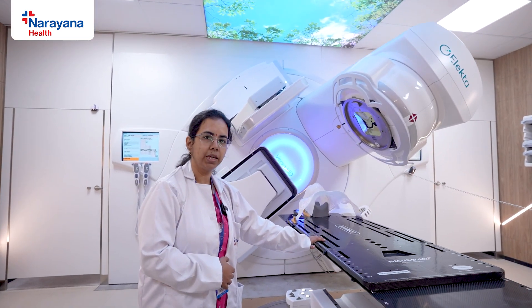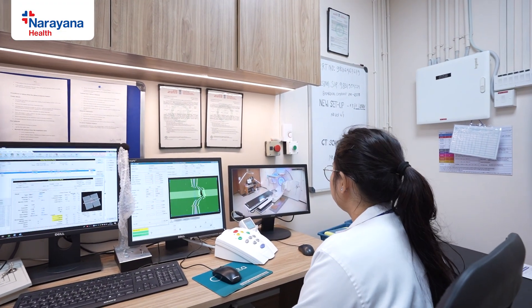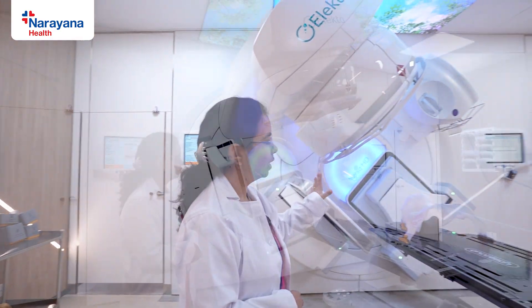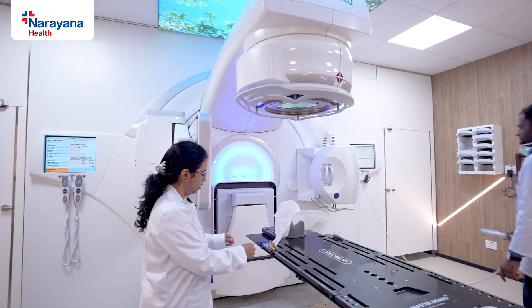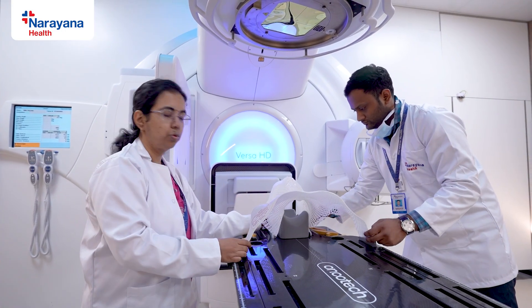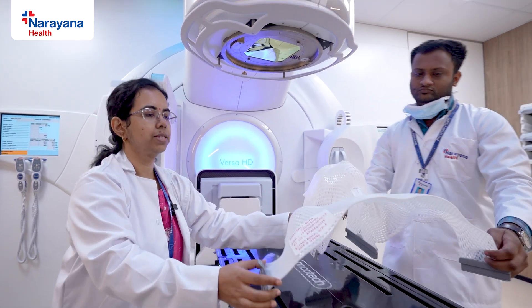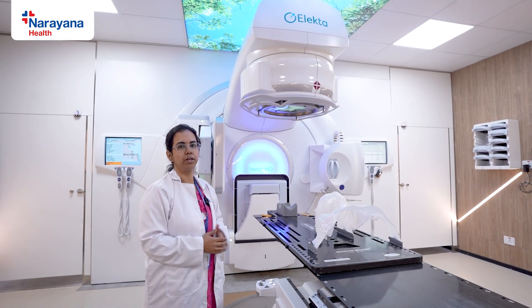If the patient has any difficulty during treatment, they are free to move their right or left hand and wave to us in one of the cameras. We then stop the treatment and approach them. Once treatment is done, the gantry moves back to its normal position. We pull the clamps and slowly release the mask from the patient's face. After the mask is removed, the patient can sit up and go back to the waiting room.